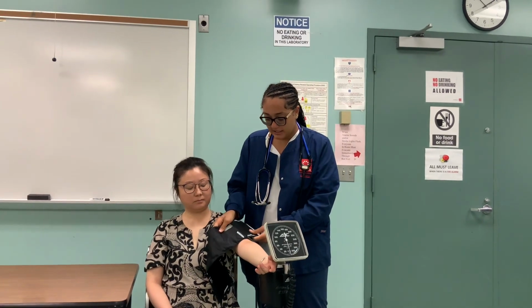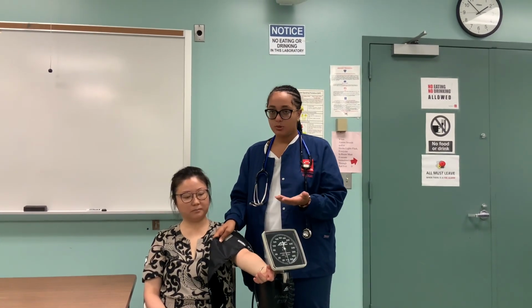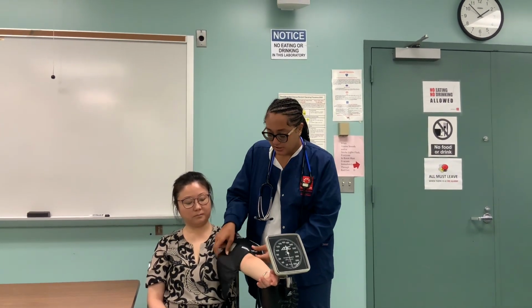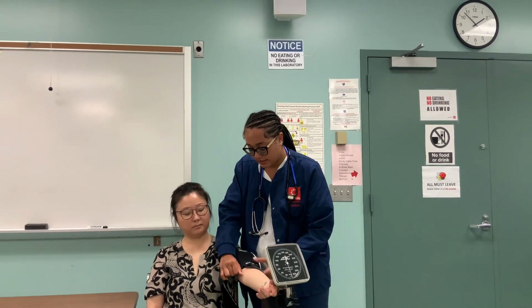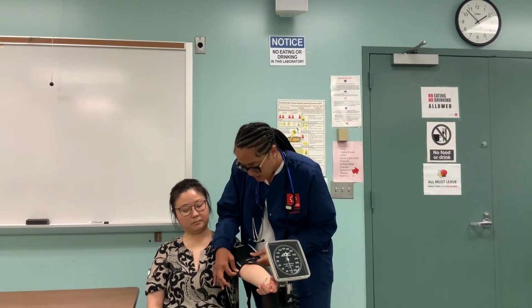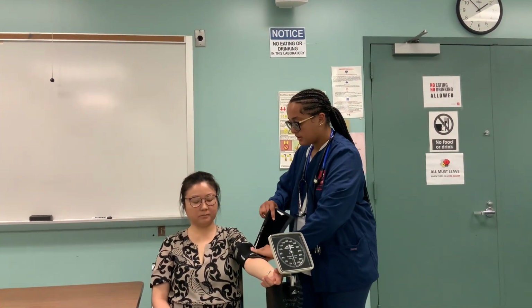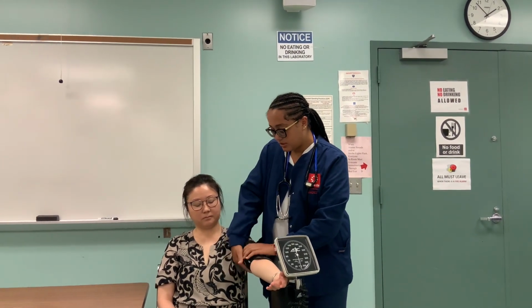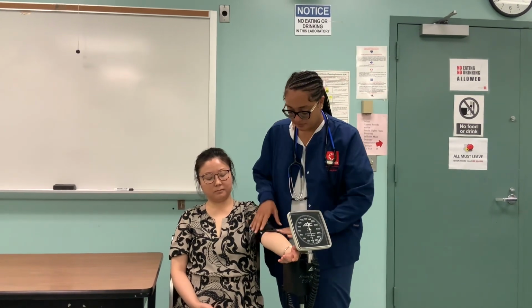And you would be placing it an inch above the antecubital space, which would be equivalent to a finger or two above the bend of the arm. So where I palpated the brachial artery is where I'm gonna align that first mark. And then you wanna wrap it where it's snug enough, but not tight. Usually to where you could slip your finger in, so you know it's not too tight.